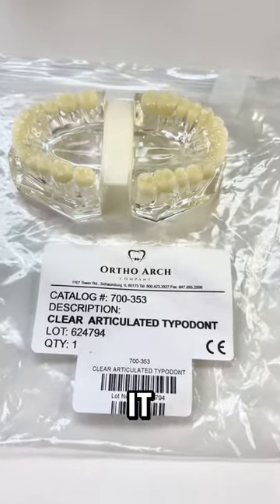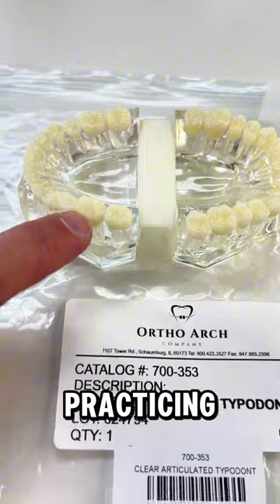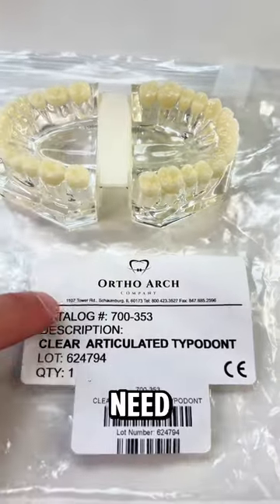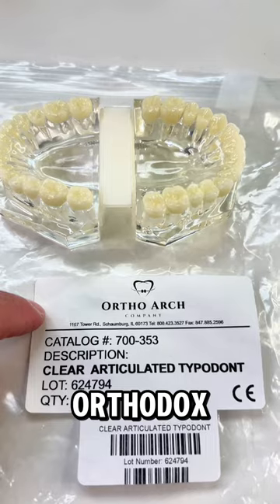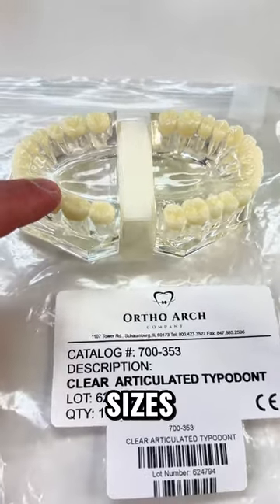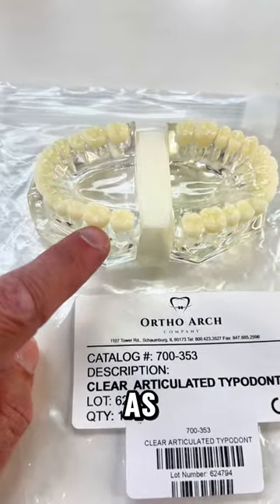You're going to need a typodont to practice placing brackets, band sizing, and practicing placing tubes on the molars as well as bands. You can use any typodont — this one is from OrthoArch. If you order it from OrthoArch, they will make sure to give you bands that correspond to the typodont sizes.